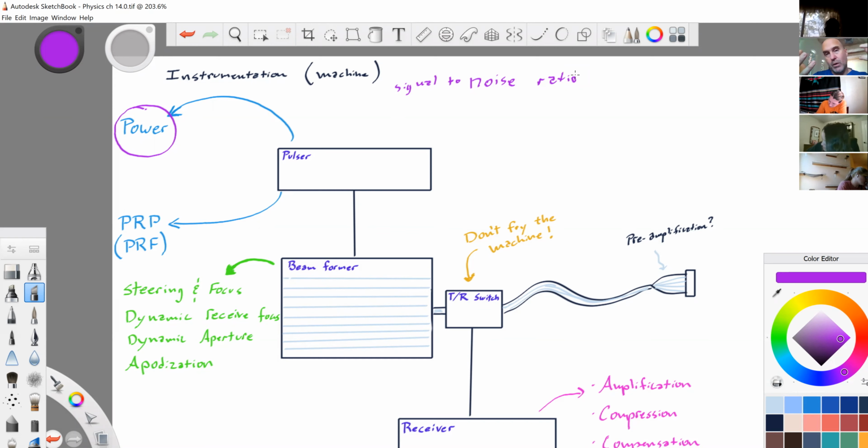If you increase your power, you increase the strength of your echoes, the real information. The noise is still there, but it's less noticeable because you have more power going into the actual useful information. Some artifacts will be increased too, but we're really talking more about electronic noise, which would certainly be better off.